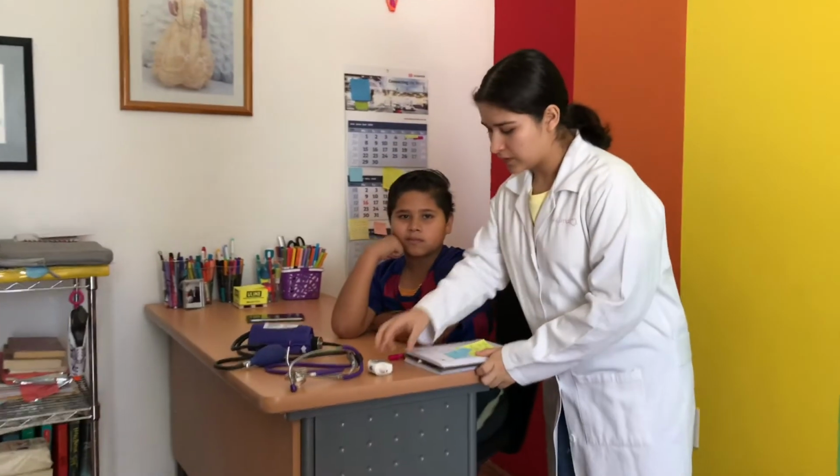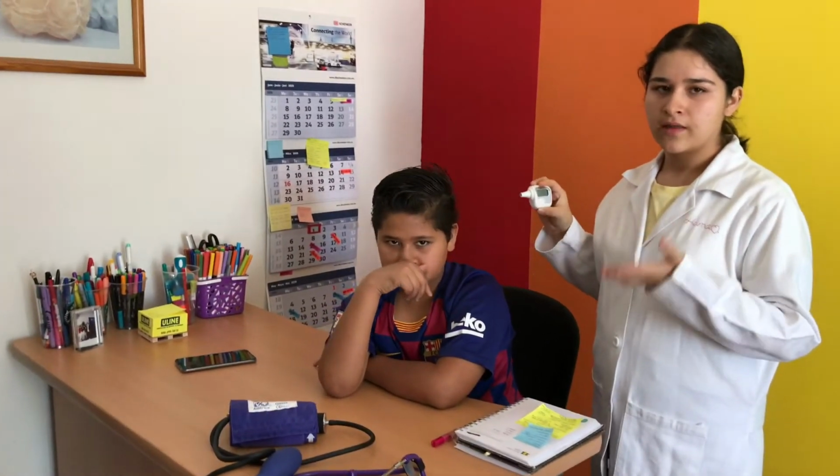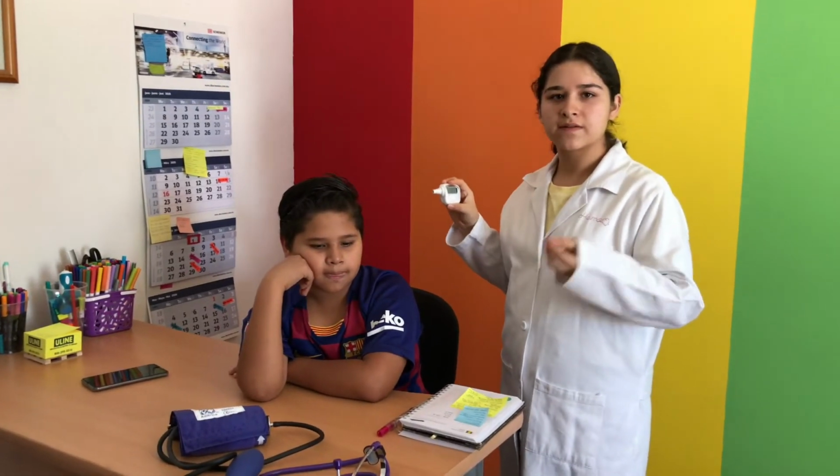Temperature can vary because of your gender, because of the activities you do, the food and fluid consumption, and also because of the time of the day. So to do this, we're going to use a thermometer and take it by his ear. This will measure the body's core temperature, the body's internal organs temperature.